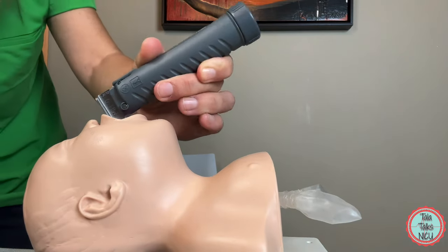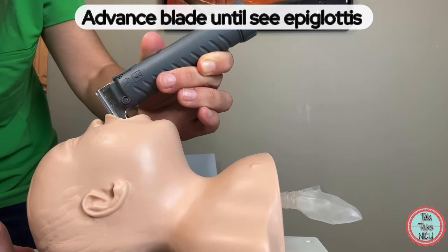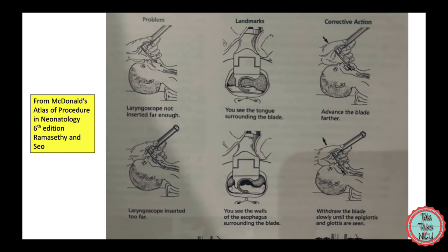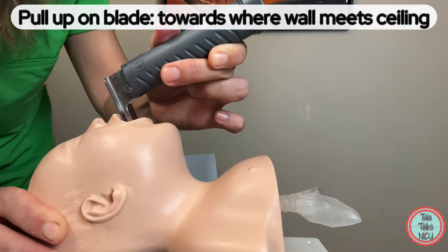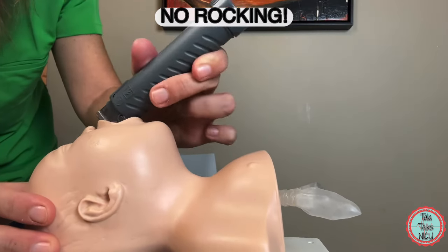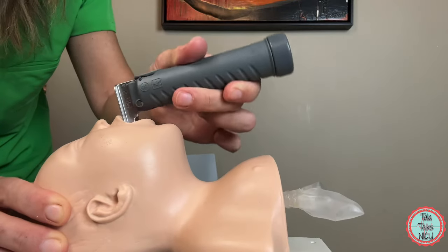At this point, you're trying to advance the blade until you can see the vallecula or at least the epiglottis. Sometimes you go in too far and have to pull back a bit to see the epiglottis drop into view. Often, especially if the vocal cords are really anterior, you have to pull up on the entire blade towards the ceiling. Do not rock — don't go backwards and forwards. It's a motion where the whole blade is lifted up towards the ceiling.